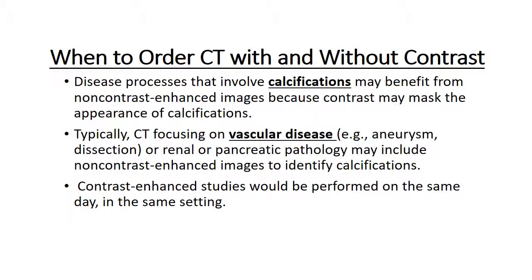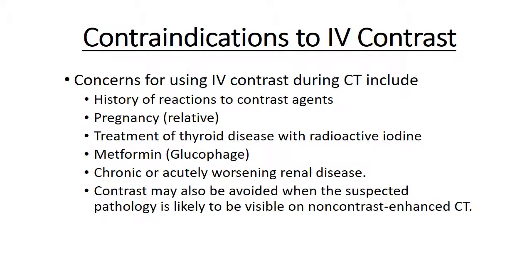And then these are done on the same day. Like I said, you basically scan the patient and then rescan them with the contrast. So contraindications to IV contrast. There are concerns for using IV contrast during CT, which include history of reactions to contrast agents. Someone who has a history of IV dye allergy, for example. Obviously, you don't want them to go into anaphylaxis as you're trying to scan them in the CT scanner. So that would be a contraindication.